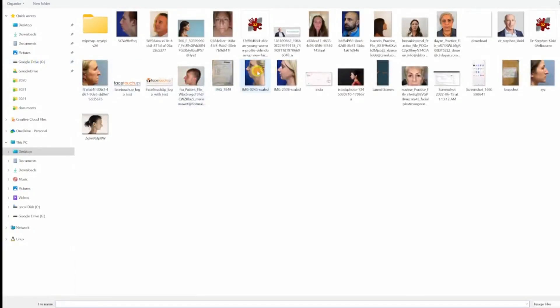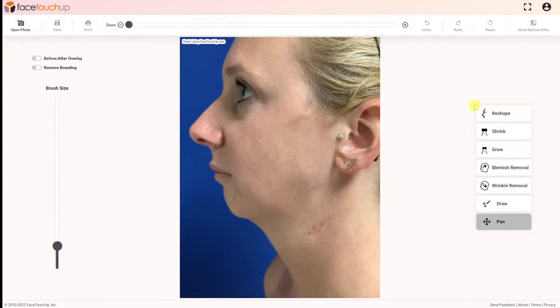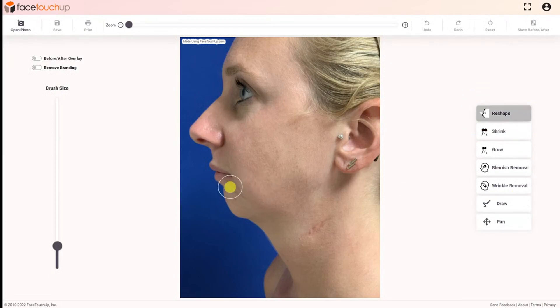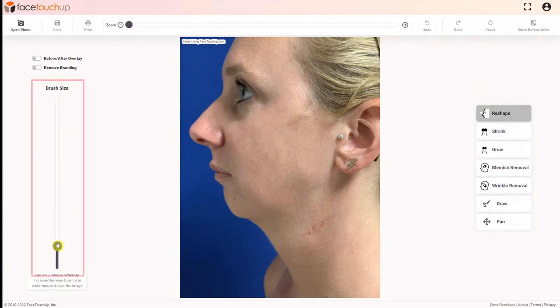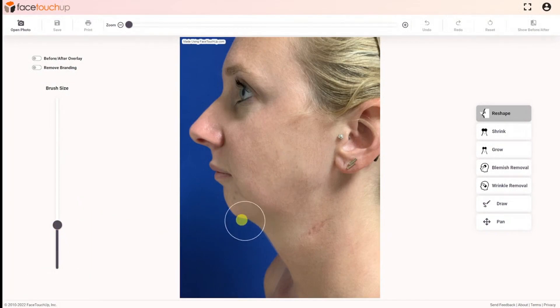In order to simulate chin augmentation, take a profile picture of your face and load it into FaceTouchUp. The reshape tool is the most helpful tool when simulating chin augmentation and neck lifts. Select the reshape tool, then adjust the brush size using the slider to vary the size of the region that will be affected.